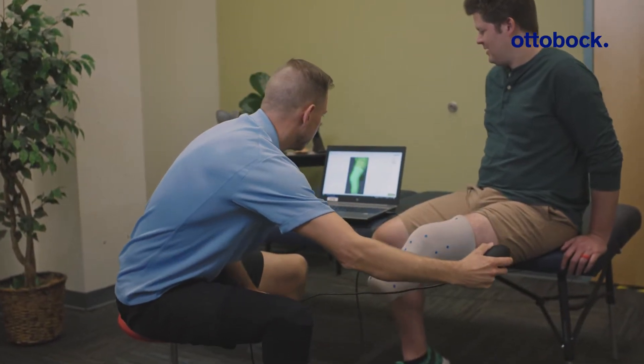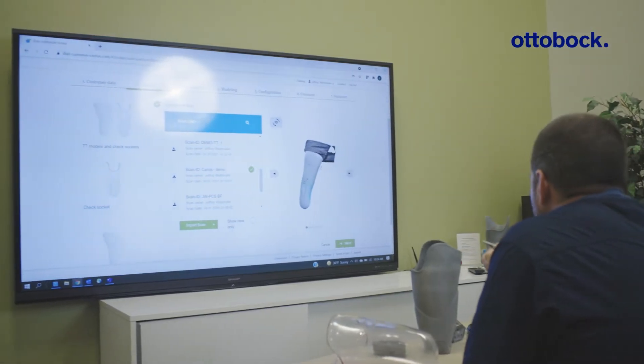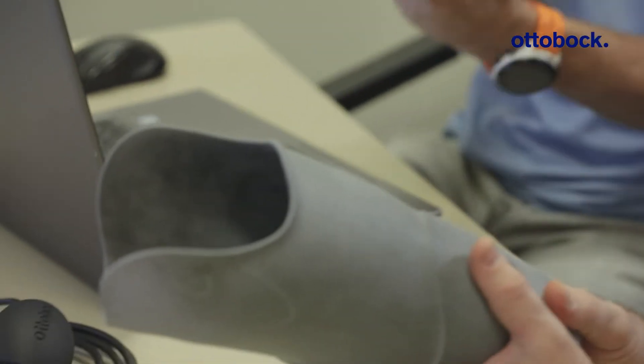The transition from plaster models to digital CAD design sockets is actually quite simple. If you can click a mouse and modify a plaster model, you can easily scan into MyFit TT. We use a simple scanner to capture the limb shape. From there we can create diagnostic sockets very similar to what you would use in normal practice, and we also create printed sockets which are your end deliverable item.